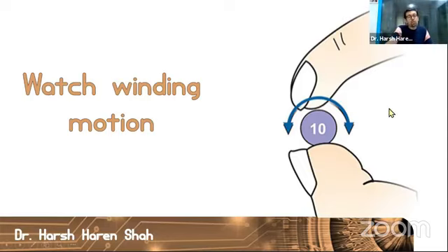In short, what you basically do is you hold your endodontic instrument and you keep going slight clockwise, slight counterclockwise, clockwise, counterclockwise, clockwise, counterclockwise. This will only be in the range of approximately 30 degrees. We will not be doing this movement for a very long time or for a very large amplitude. We will only be going up to 30 degrees.